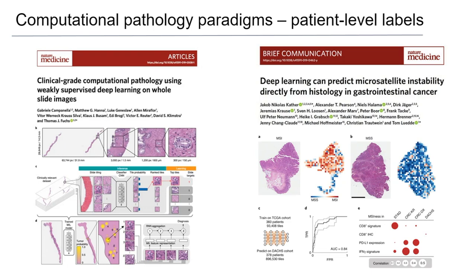There's a lot of popular work right now in trying to predict genetic alterations from H&E. And so the idea here is that you could sort of pre-screen people and rule people out, and then apply sequencing to the others. And it doesn't really give you a good enough prediction of, say, a variant to be able to replace the genomics, but it does give you a lot of value for $4 of H&E and some computation. So that's, I think, an interesting approach. It also uses this sort of patient level learning type of algorithm.